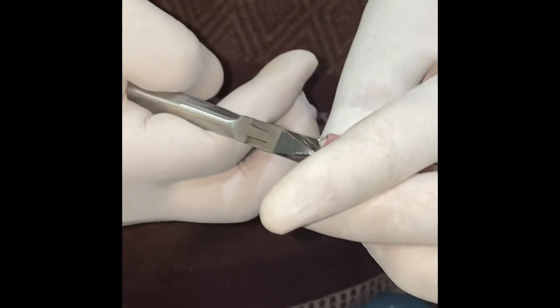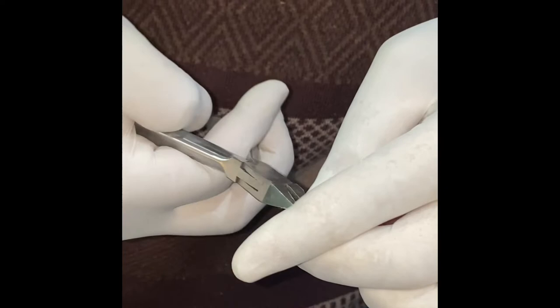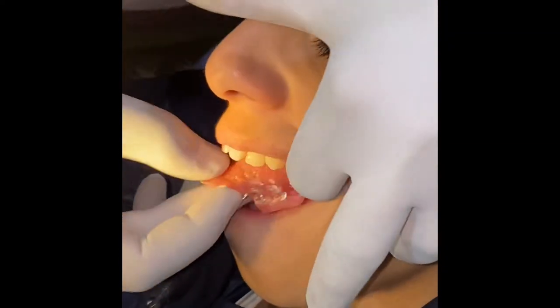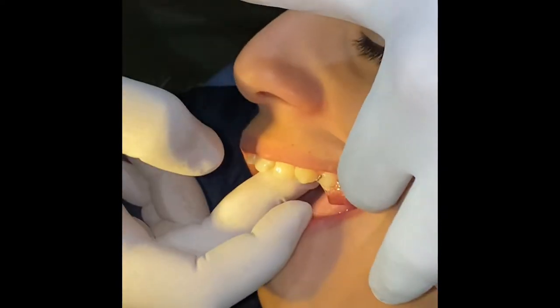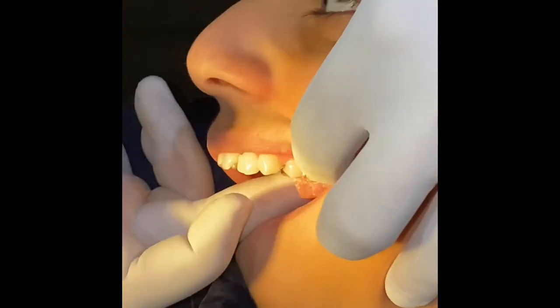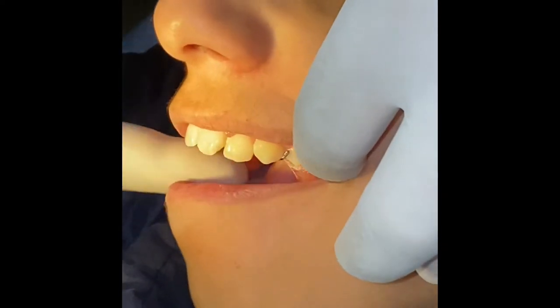Now you can see this will not interfere with the wire. And we are getting almost an equal amount of retention from the left and the right side.